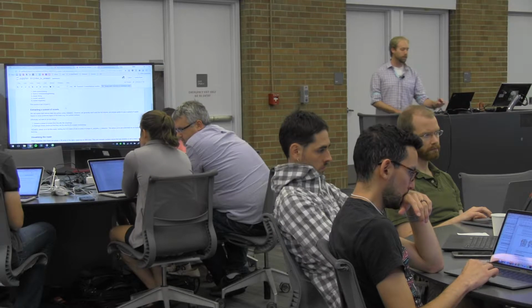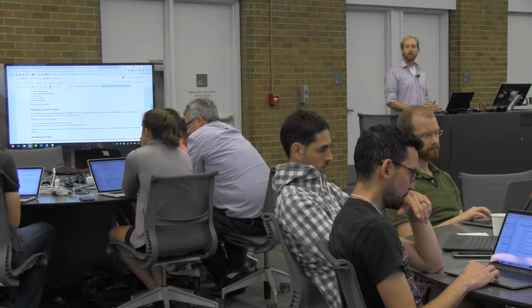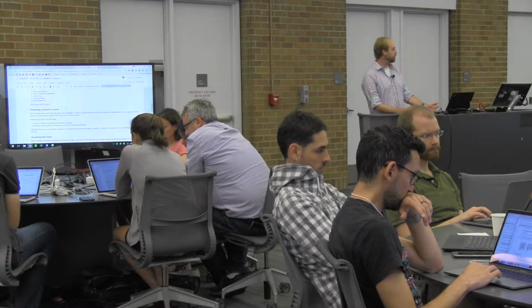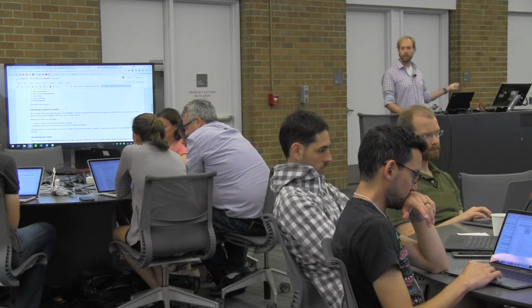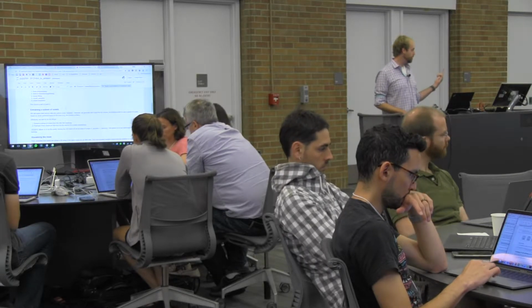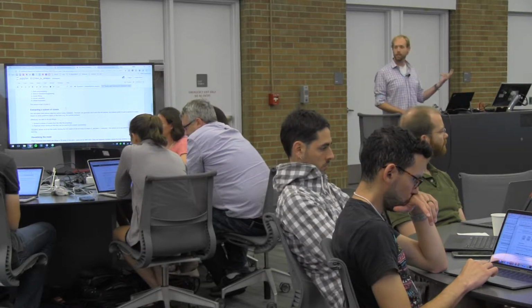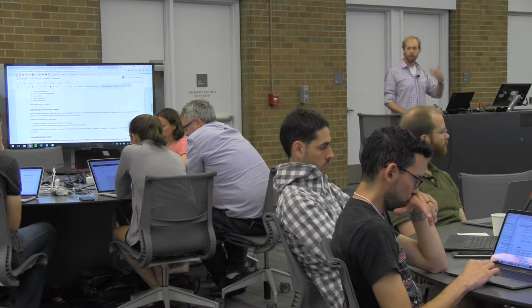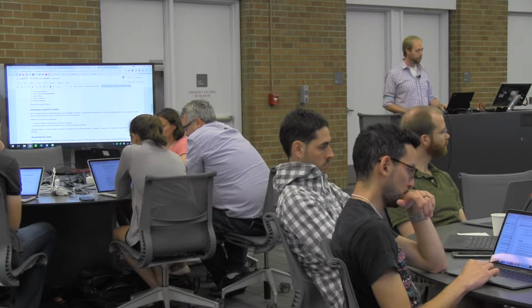So effectively, when we're doing any kind of machine learning in neuroimaging, we're usually doing two things. First, we're pre-processing the data some amount. Next, we're doing some kind of feature extraction. And then I guess a final third step is, after we define the features that we want, we vectorize them so that they're in a form that we can put into Scikit-Learn.